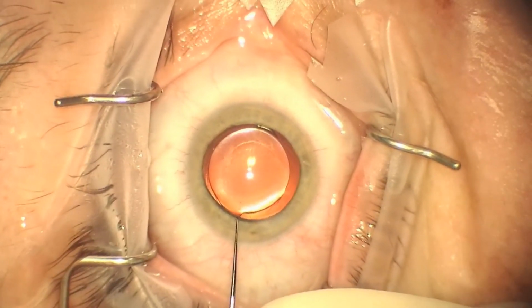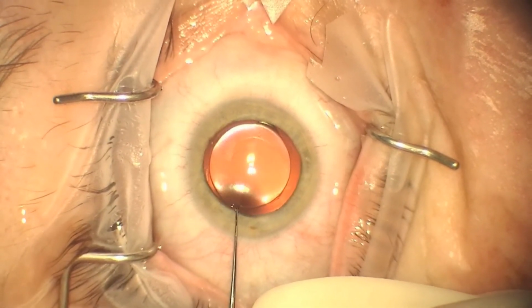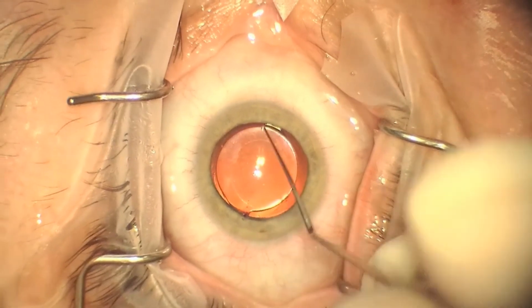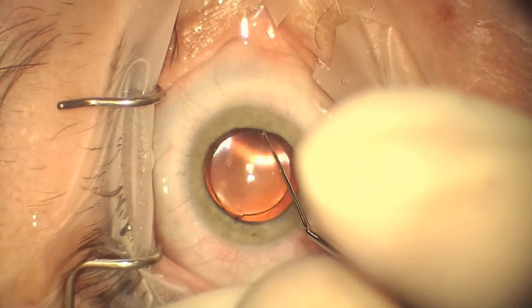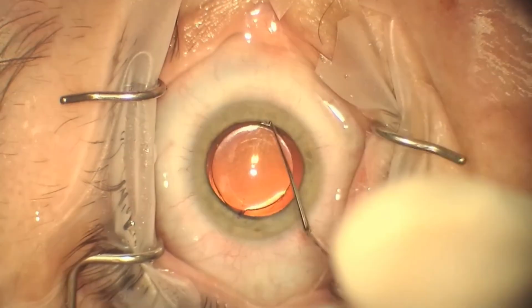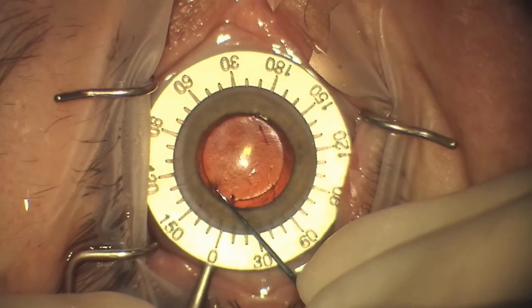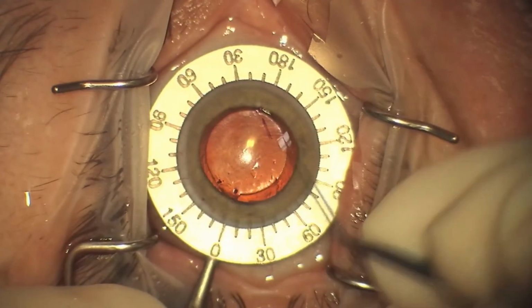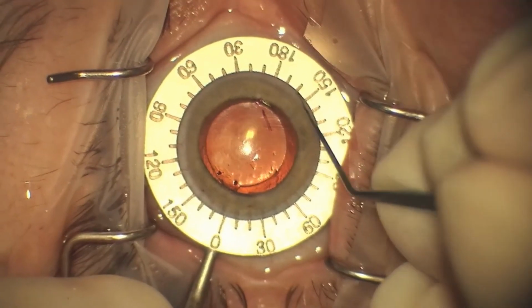Then we mark the cornea, marking the point where the IOL is currently and where we want to rotate it to. Previously, we used our website, www.astigmatismfix.com, which calculated that the IOL should be rotated approximately 30 degrees clockwise.